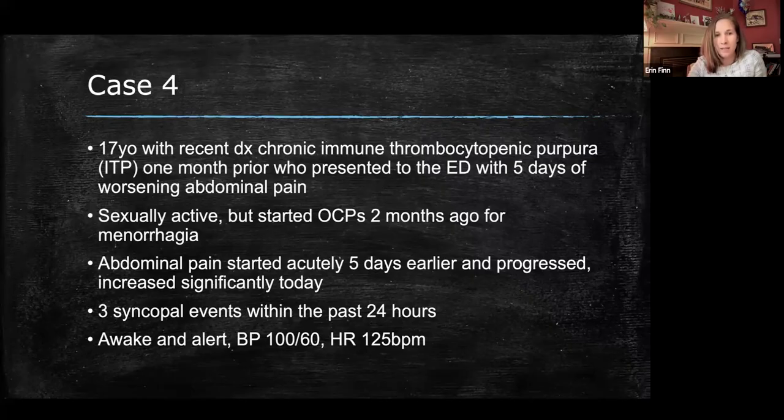On exam, she's awake and alert. Her blood pressure is 100/60 and her heart rate is 125 beats per minute. So just with that history, is there anything that you all want to start with or anything that you're thinking about right off the bat?